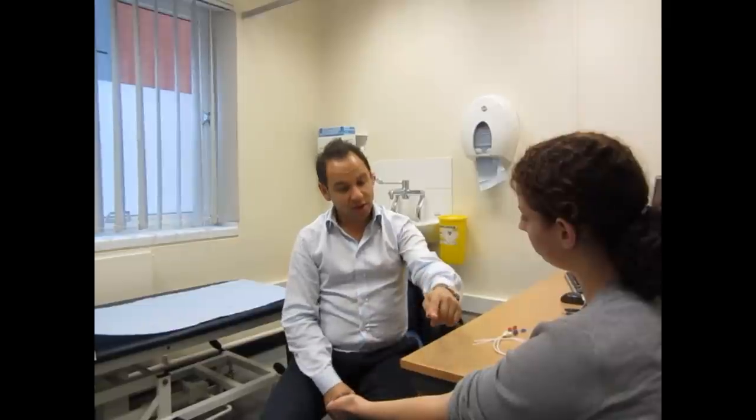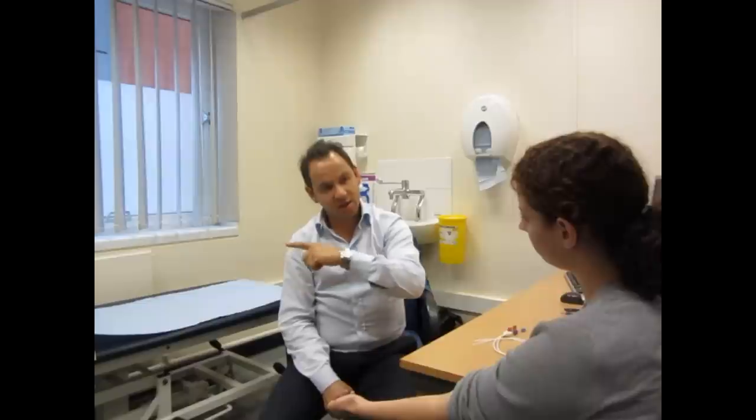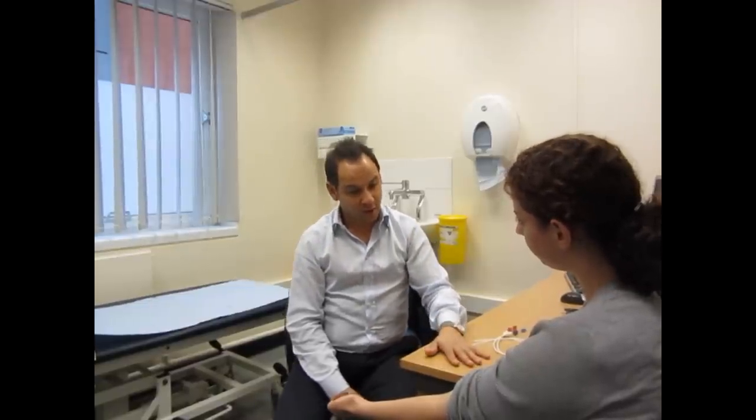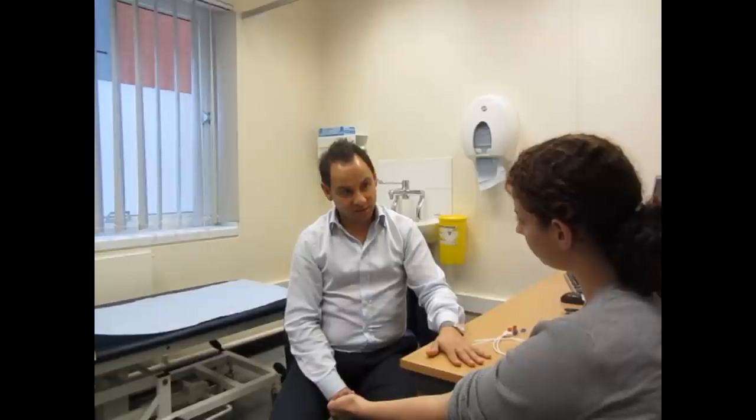And that blood is taken away at quite high pressure. So we need about 600 mils per minute of blood going from your fistula to the machine and back again. And fistulas do work very well, and there are some main advantages of them.